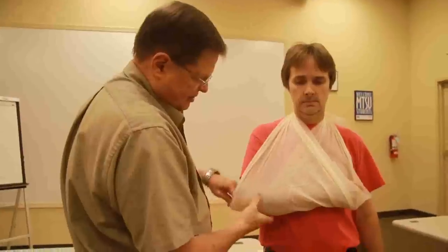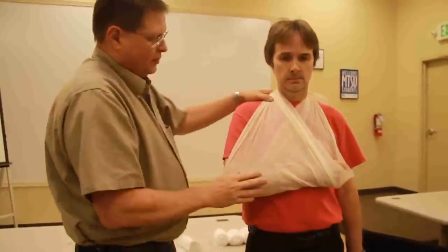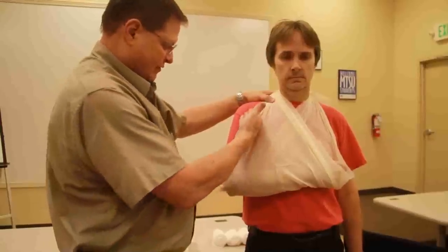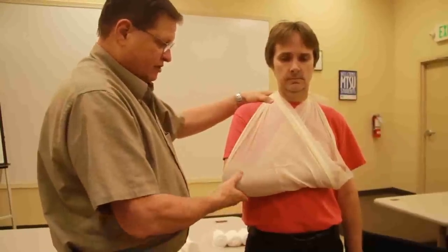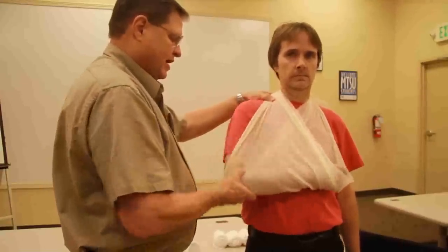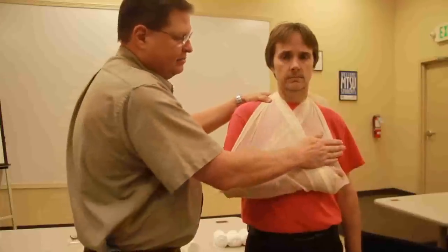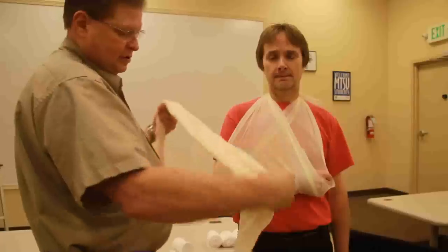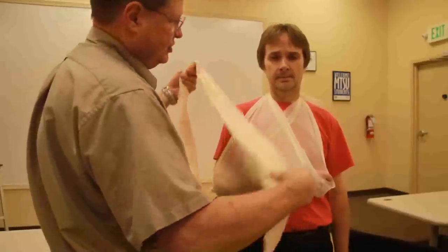Now you can see he's got this. The principles of splinting are that I have to immobilize the joint above and below. So this immobilizes the joint below pretty well, but it doesn't have anything to do with the joint above. Now I need to put on a swath. What I'm going to do is I'm going to use my cravat, and I'm going to use it for a swath.